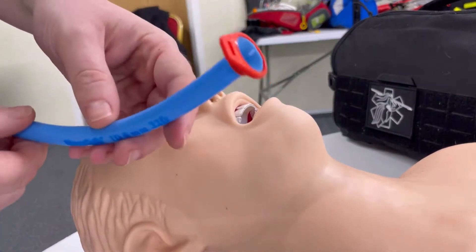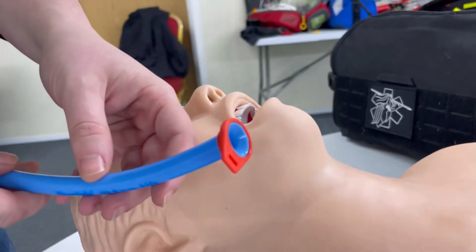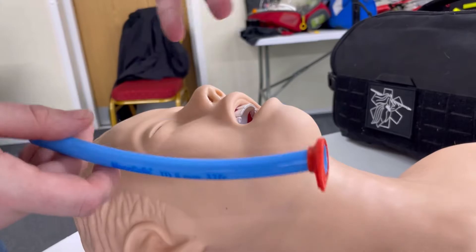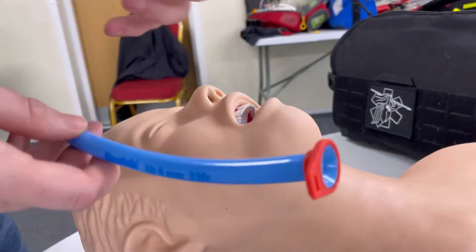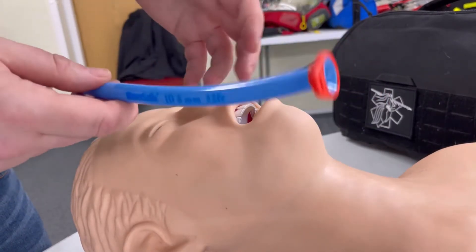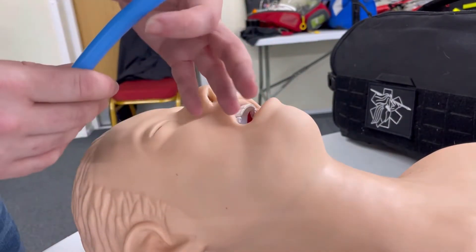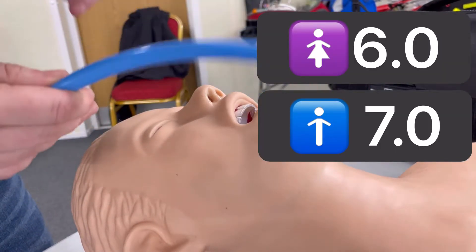They come in different sizes. For adults, they tend to be sixes and sevens. They do come in paediatric sizes, but they're very uncommon in pre-hospital care. It's not something that I see much of as a paramedic — we tend to resort to oral pharyngeal airways or more advanced airways for paediatrics that need it. Generally you'll see them in a six or a seven. A size six will fit an average size female and a size seven will fit an average size male.